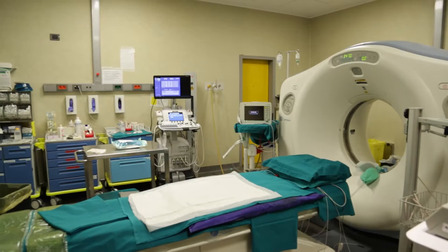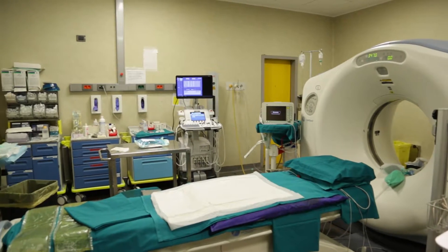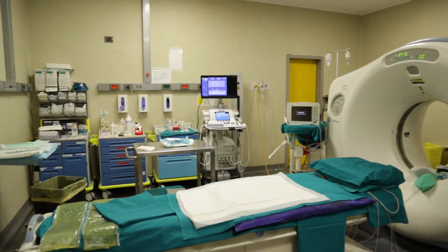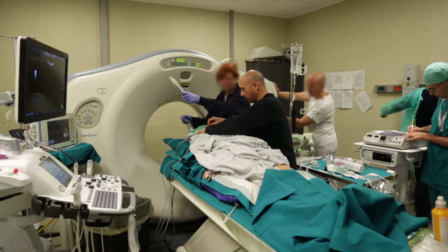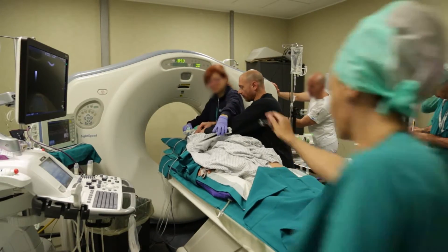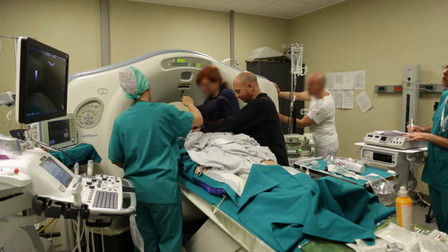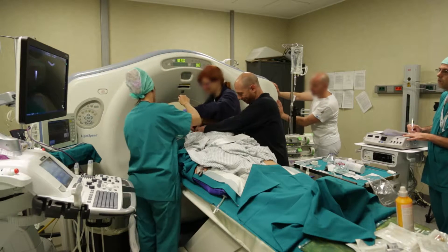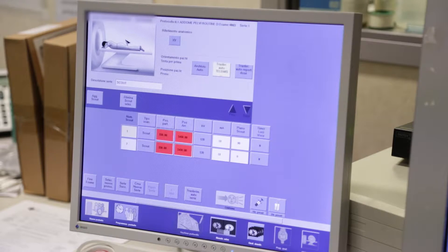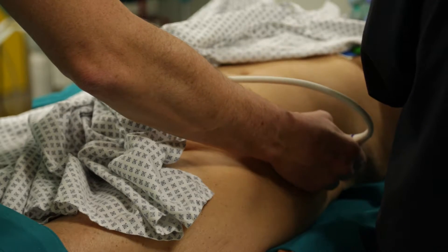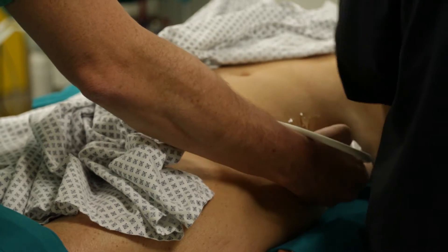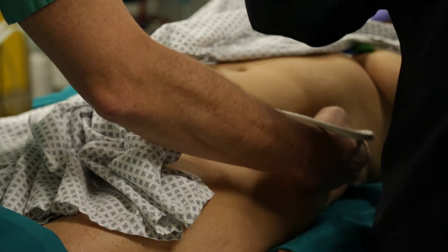On the other hand, referencing a CT dataset fused with the live ultrasound imaging makes it simple to visualize the target and the needle pathway. It is easy to determine the needle entry points on the skin.